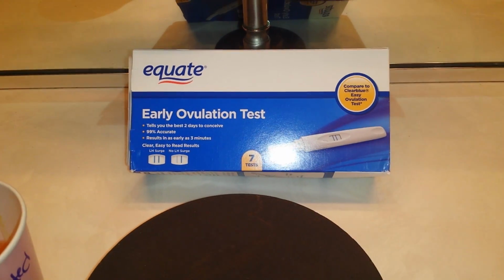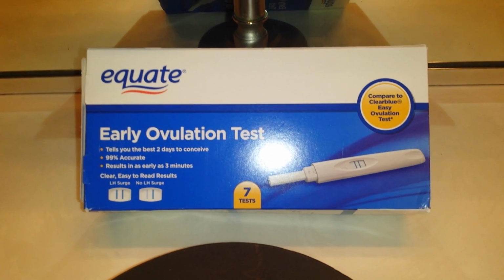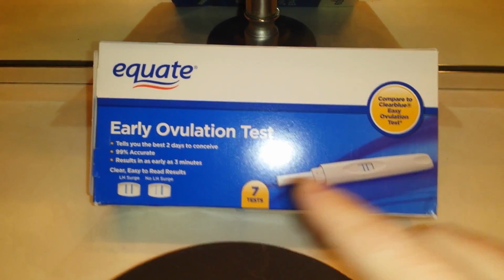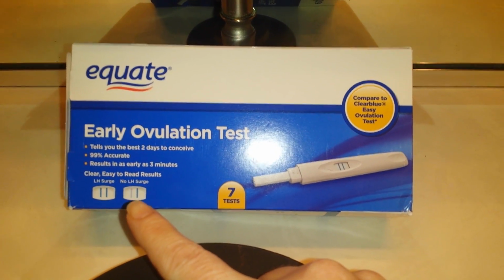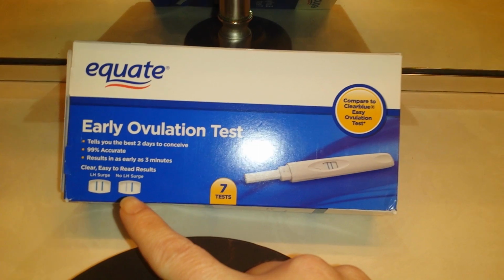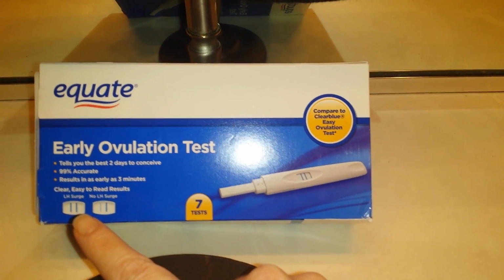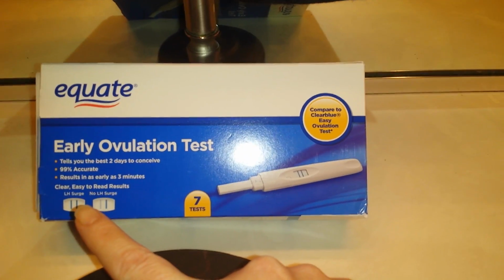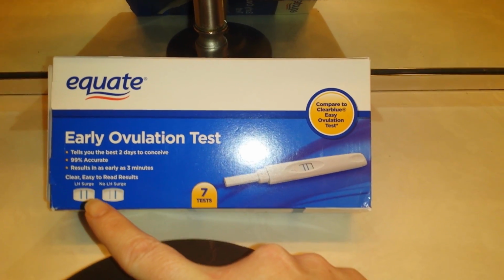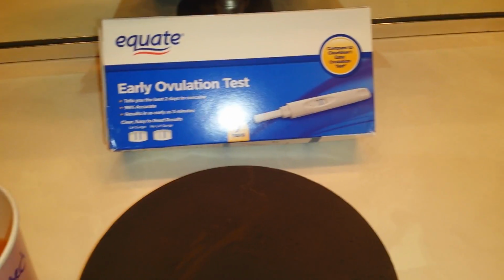Anyways, with what I was saying, because of the LH surge that's constantly running through our systems, whenever you get a result, you typically have 2 lines because it's going to pick up on some kind of surge. With a pregnancy test, if you get a second line, it's considered positive. With an OPK, you want 2 lines, and you want the test line to be equal to or darker than the control line, and that's what you would consider a positive. So that's how that works. Now, here are my thoughts.